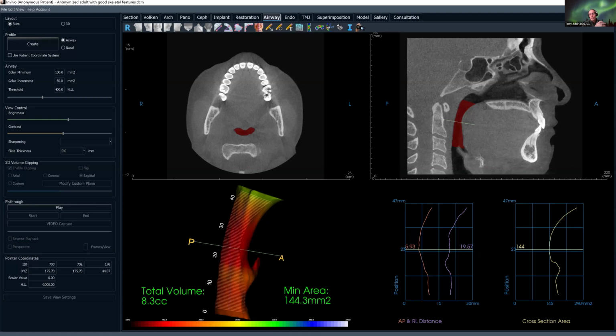A lot of these things they are unaware of, even opacification of the maxillary sinuses, which is very common. So its clinical significance is that it could be an indication of a localized infection, or it could be an upper respiratory infection. I think we have an obligation, and it's easy enough to say that I find this, it's almost always a subclinical presentation. If you're interested, we can come back and re-image it sometime in the future, or a referral to your physician or ENT would be appropriate. It usually just represents a focal infection.